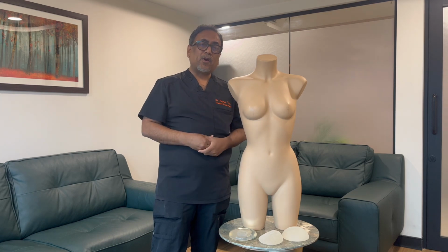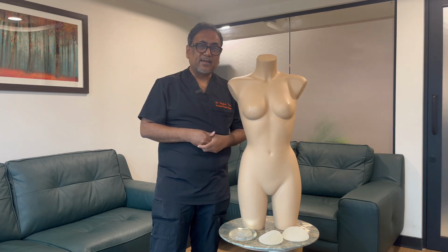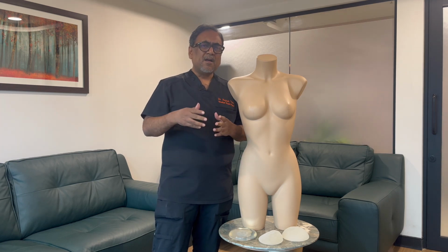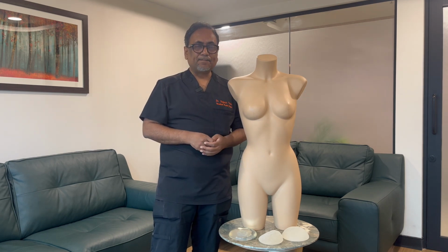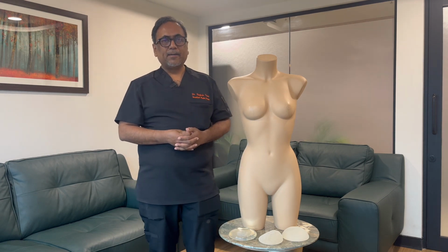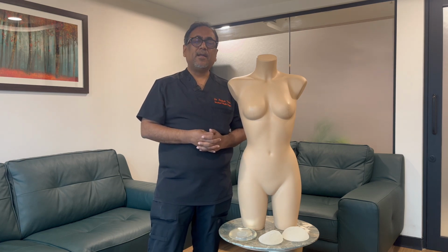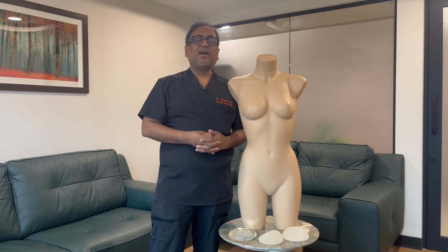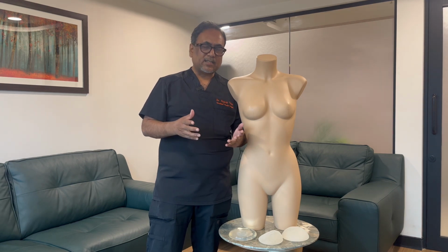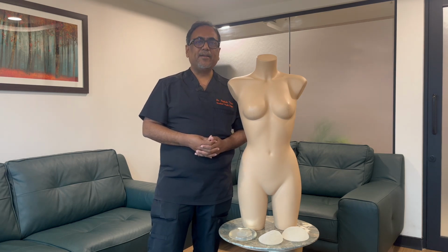Now, there might also be a lot of myths and misconceptions regarding the breast implant. The biggest myth which patients may have is the possibility of a cancer. Yes, cancer is a very important point to discuss with our patients. However, the risk is very, very minimal. It's almost like 1 in 80,000 patients who may possibly get a cancer called breast implant related anaplastic lymphoma. This is such a rare complication that we don't consider that our patients need to really worry about this.